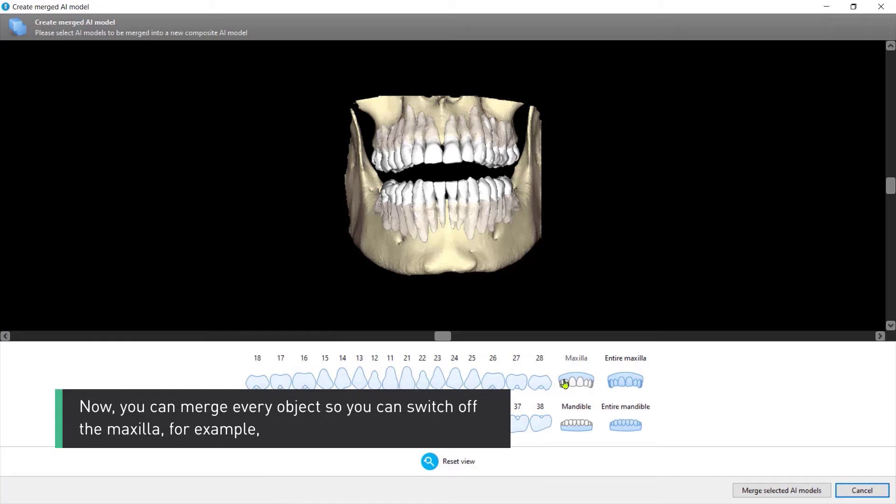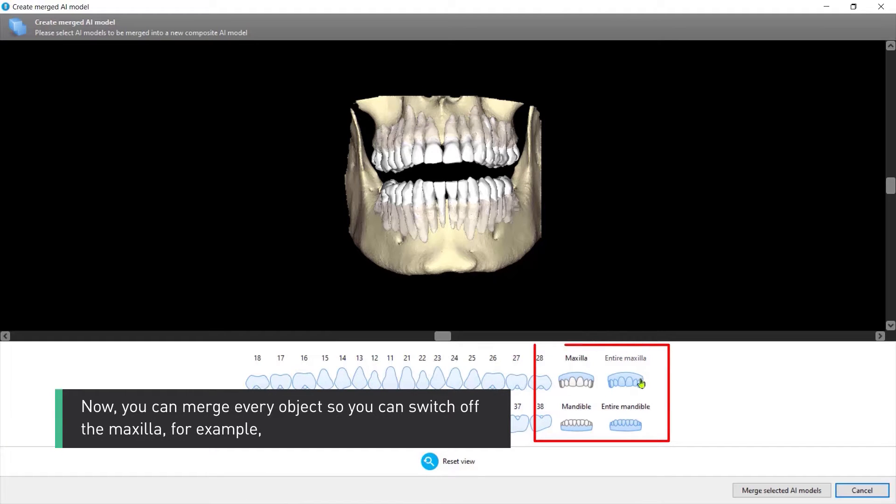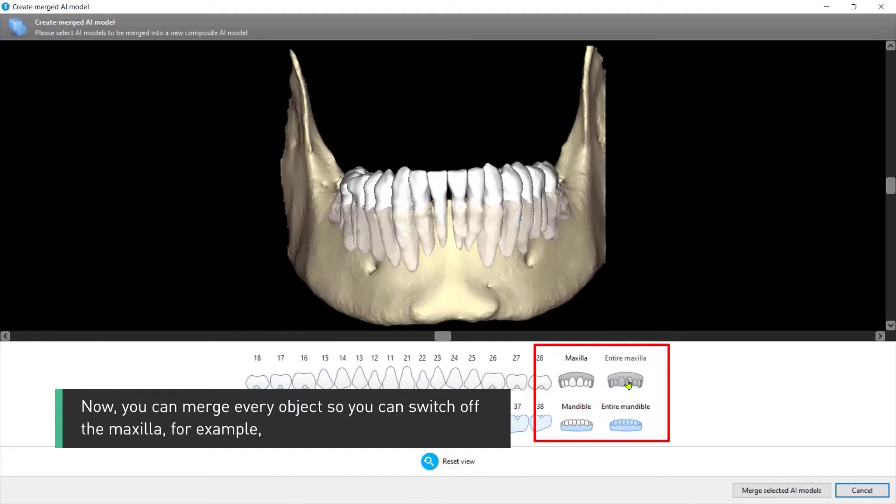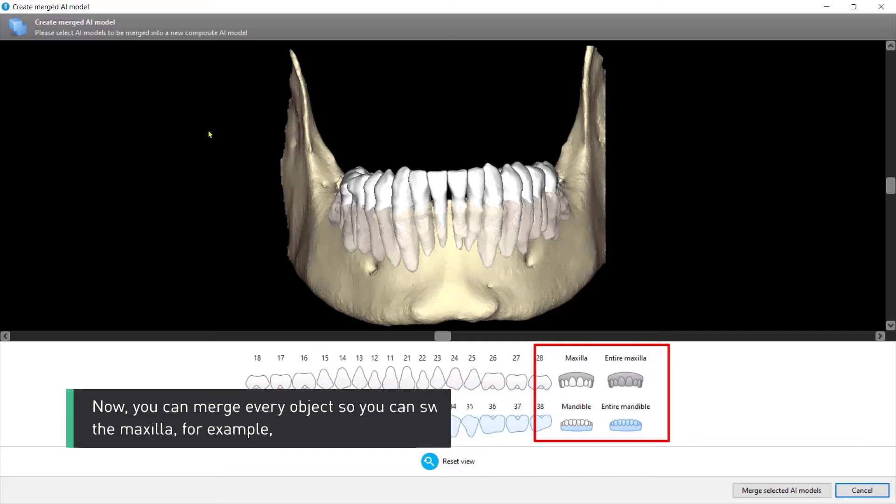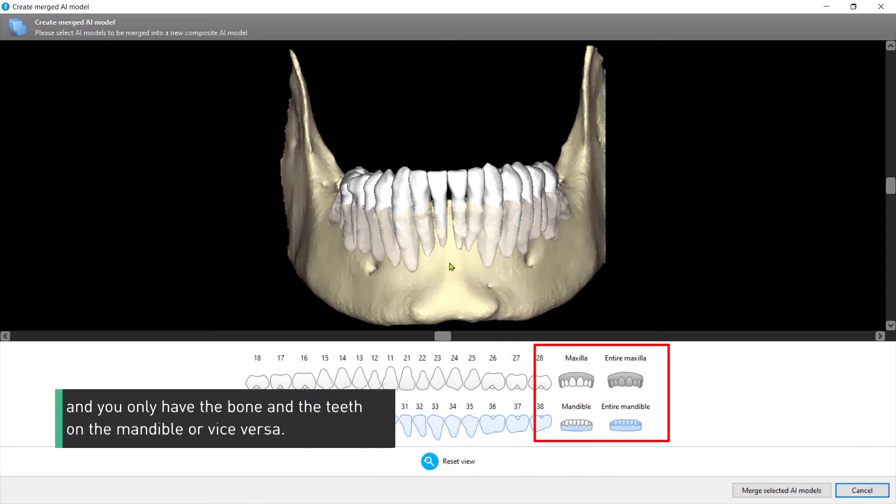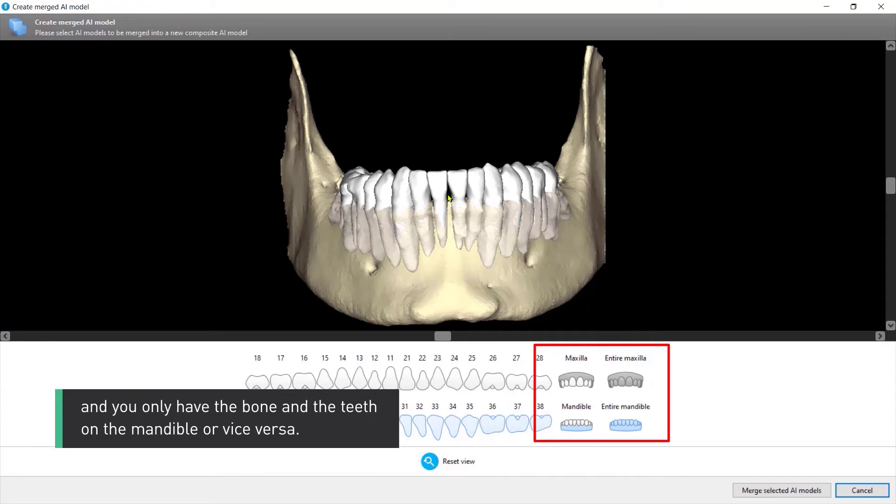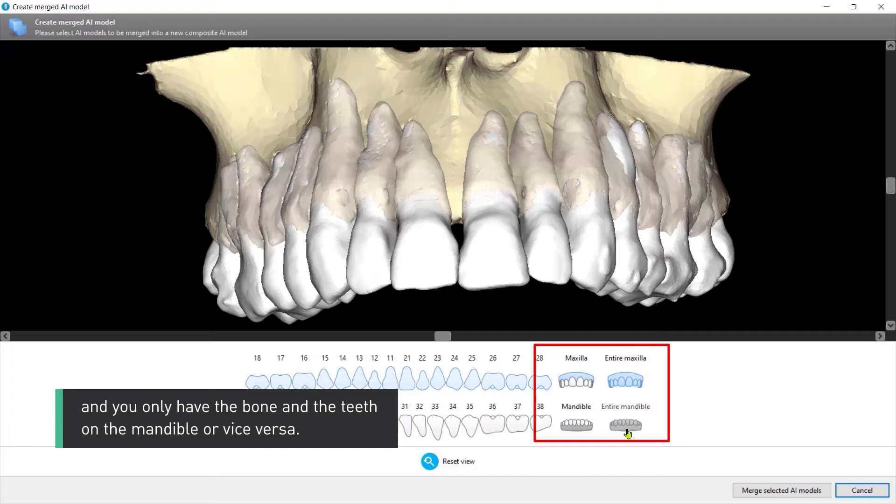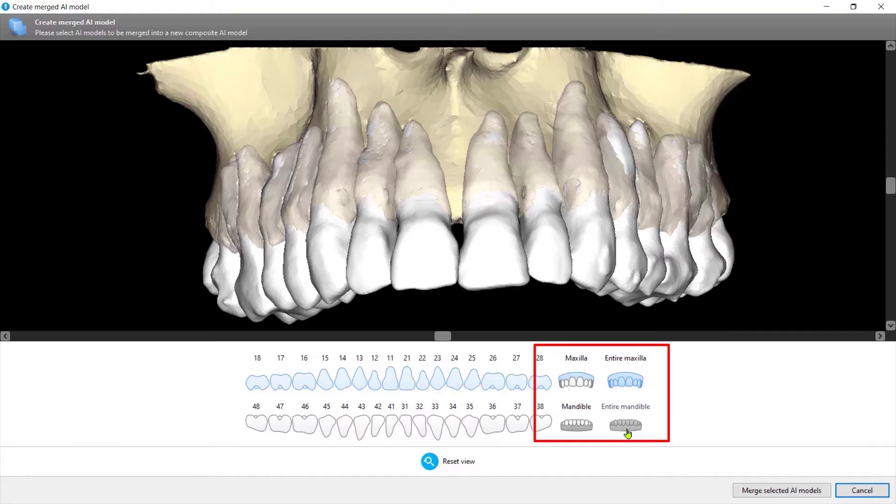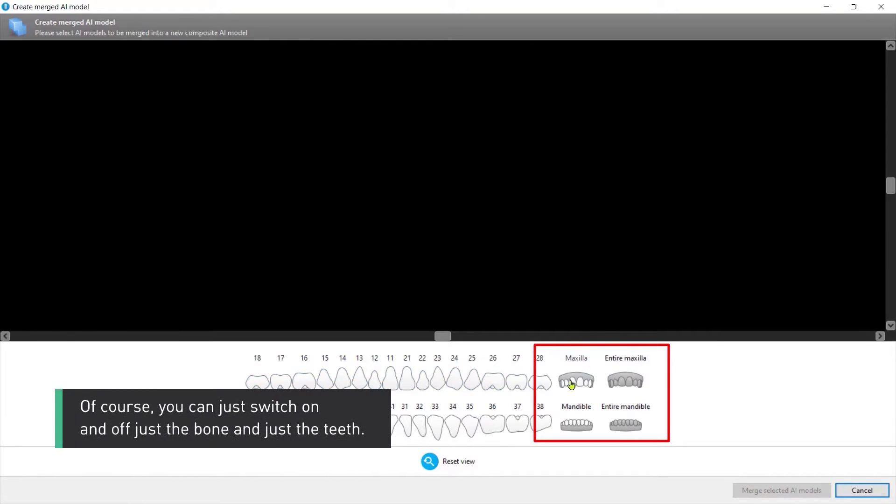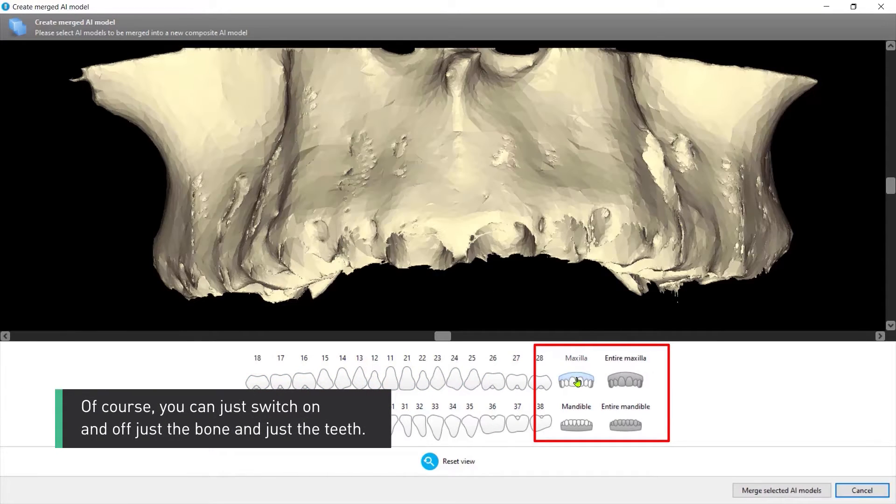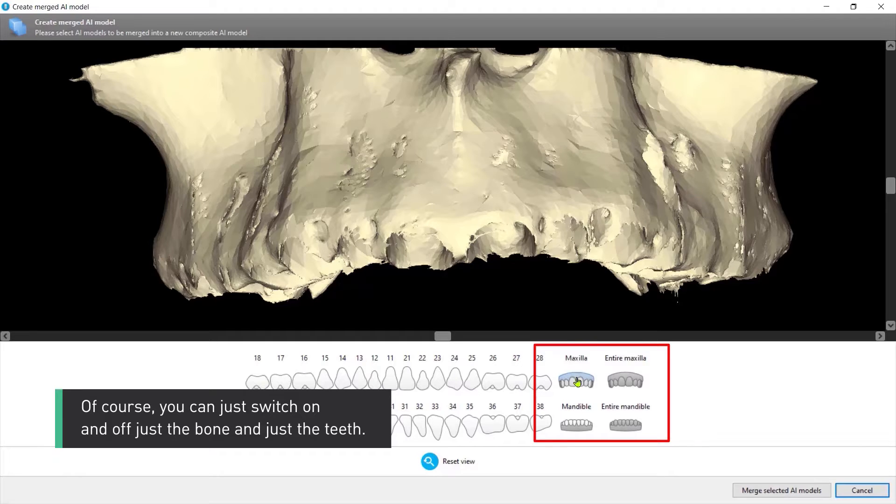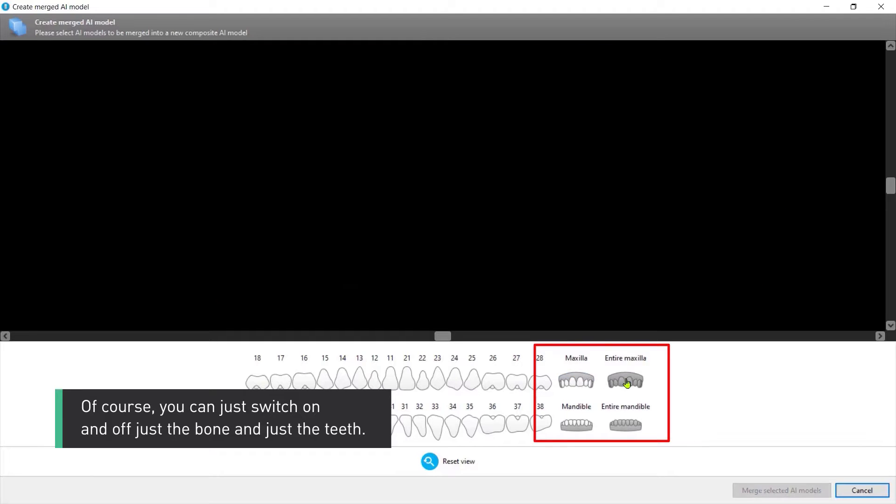Now you can merge every object so you can switch off the maxilla for example and you only have the bone and the teeth on the mandible or vice versa. Of course you can just switch on and off just the bone or just the teeth.